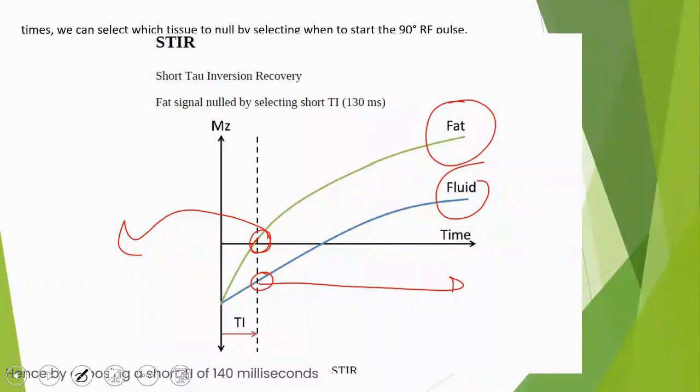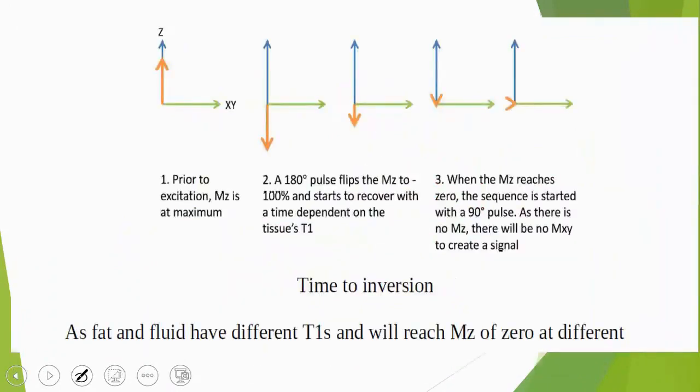Okay, the amplitude dropped in this way and is around 130 milliseconds. After the 180-degree pulses are applied, the signals return to near zero point or null point.